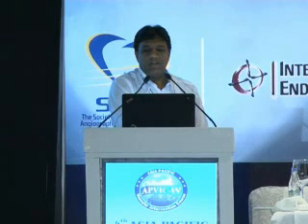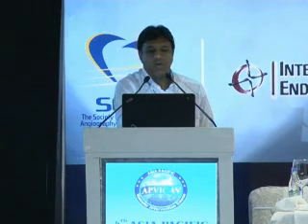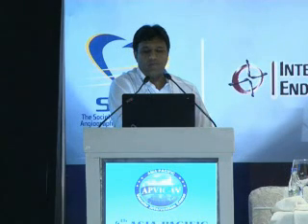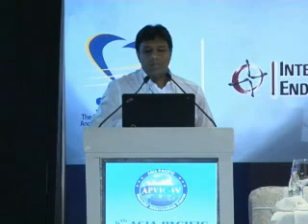These are the balloon expandable stents. Balloon expandable stents rely on inflation of an angioplasty balloon to expand the stent from its collapsed configuration and push it into contact with the vessel wall. Most contemporary stents are factory mounted on the balloon.